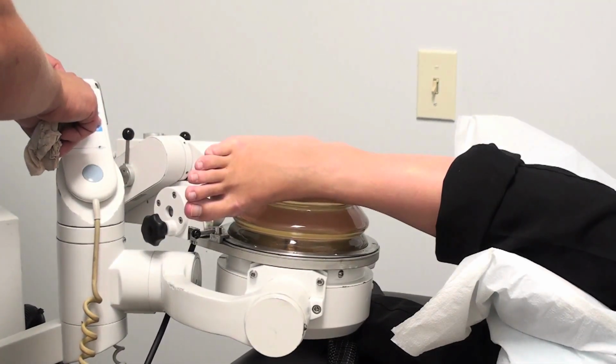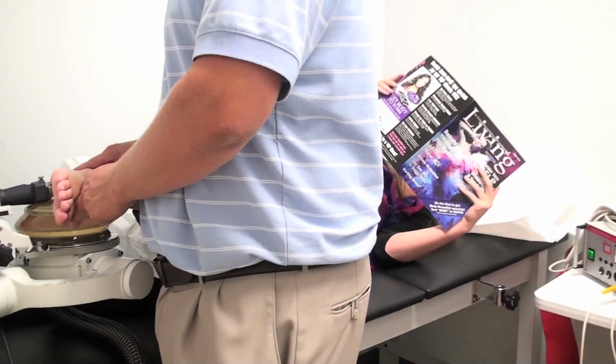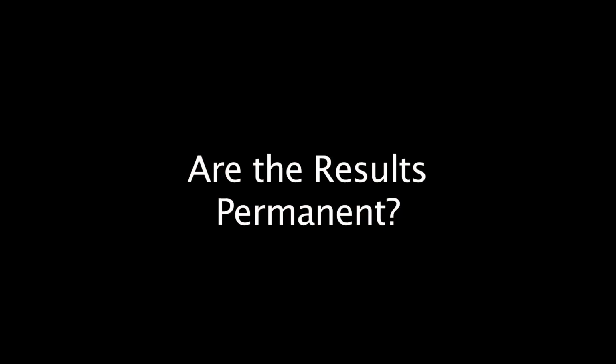We're going to start the process, and once we start the machine, it basically takes about 18 minutes for it to run its cycle. We're going to build up in its intensity. It's going to move a little bit faster each time. You'll hear the shock waves, and they're going to tap a little bit faster, but all in all, it'll take about 18 minutes for it to finish its cycle. It may feel like a little bit of a rubber band snap, but other than that, the worst part should be over.